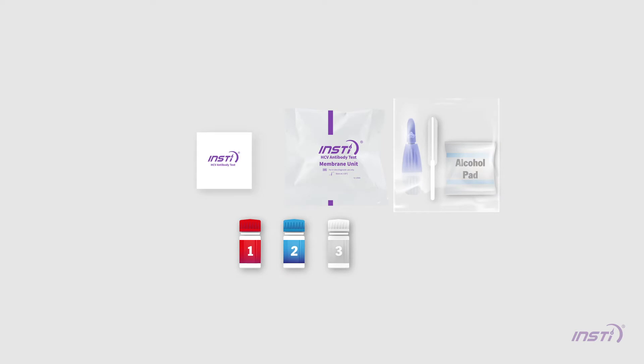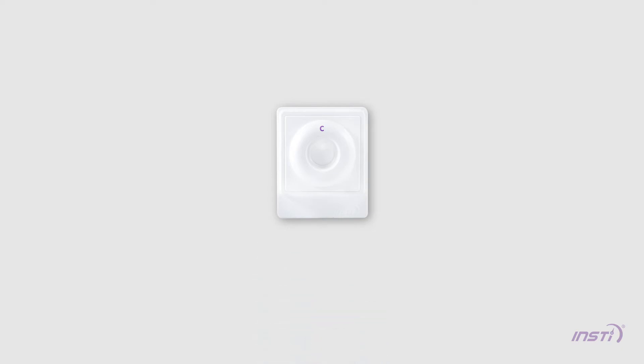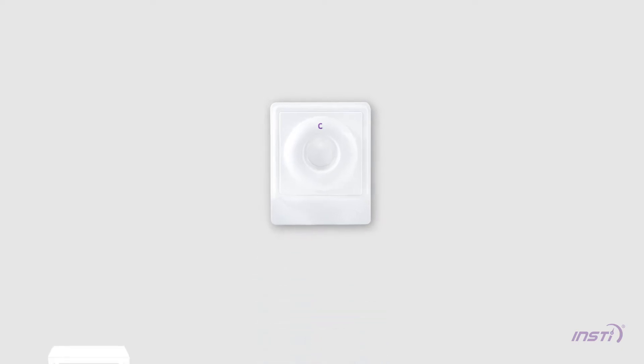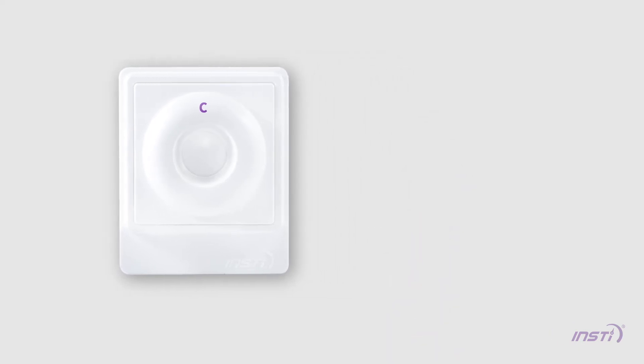Open the INSTE package and remove all contents from the pouch. Tear open the membrane unit pouch at the pre-cut edge and carefully remove the membrane unit without touching the center well. Place the membrane unit on a flat surface in a well-lit area. Make sure the tab of the membrane unit is oriented towards you.